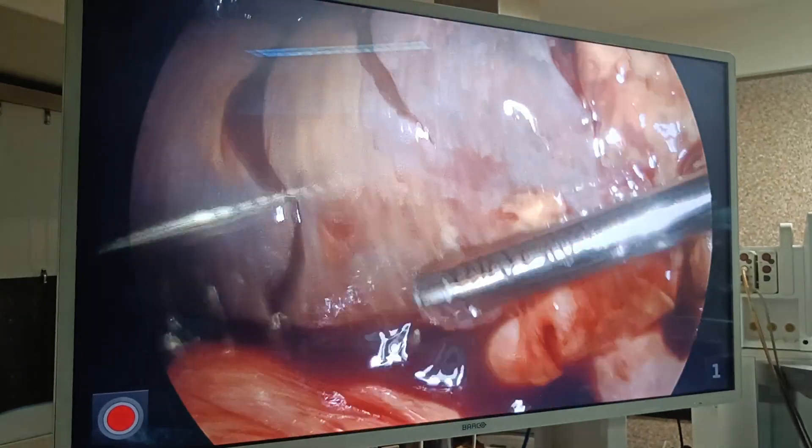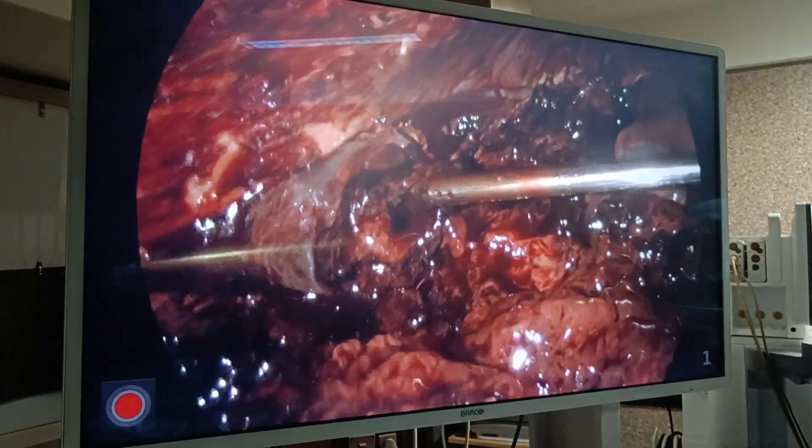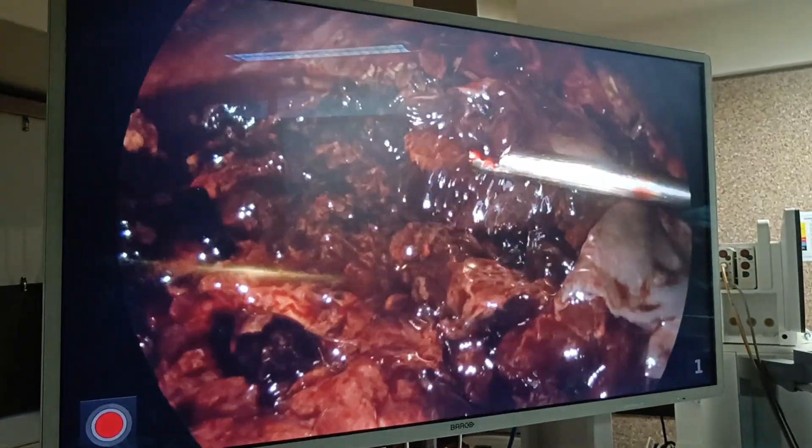This is the lower surface of the liver. Can you see this? This is a hematoma. This is the whole hematoma, this is the whole liver parenchyma. Now we are not going to do too much.